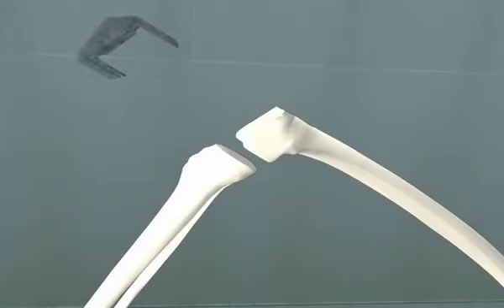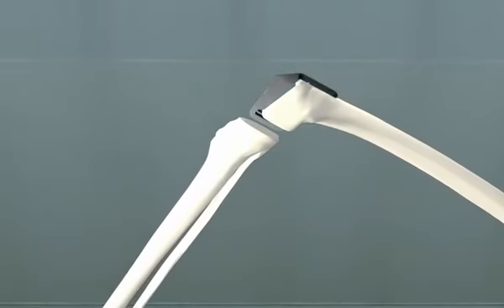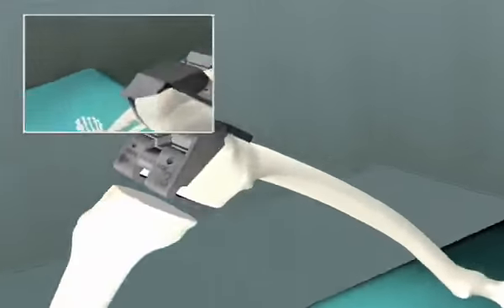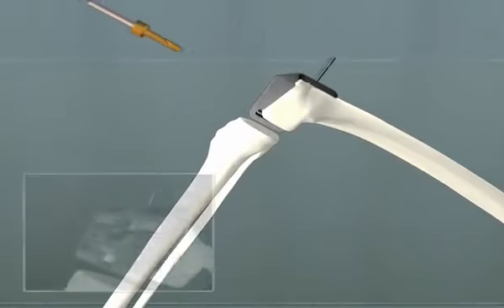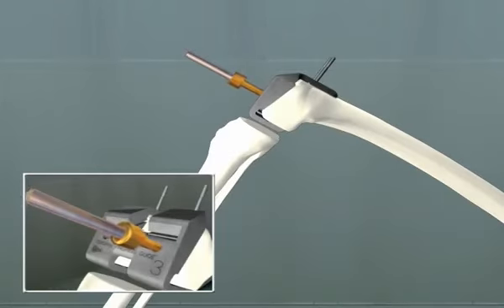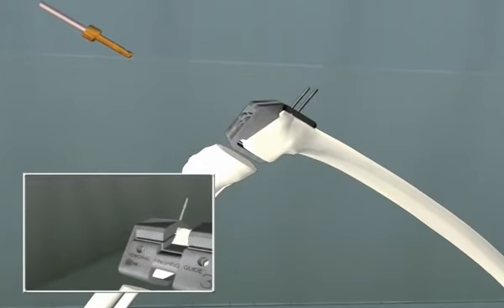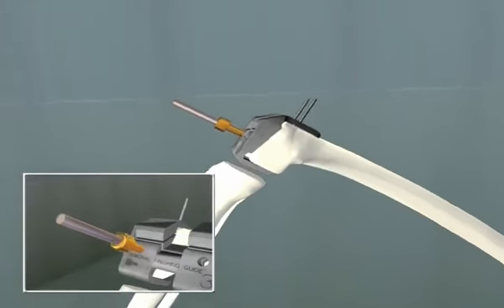The finishing resections of the distal femur can then be made through one guide, which is centered on the epicondyles of the femur. It is pinned into place. And the 2 drill holes are made with a 1/4-inch stop drill.